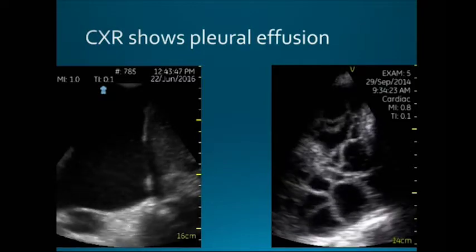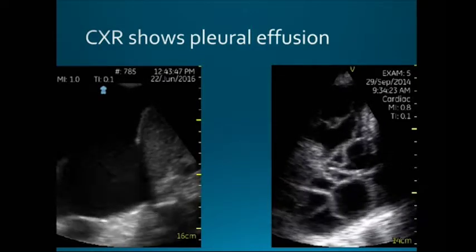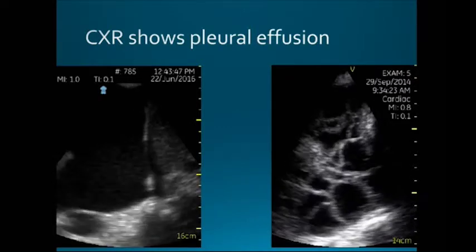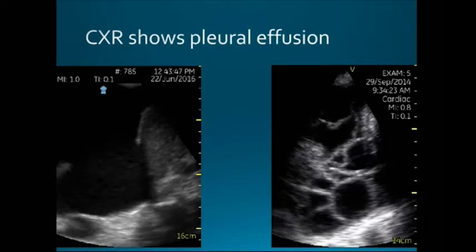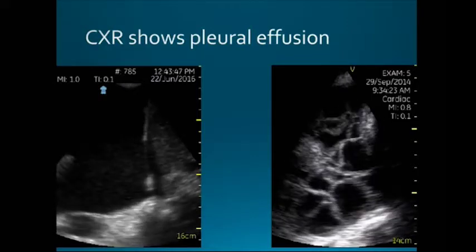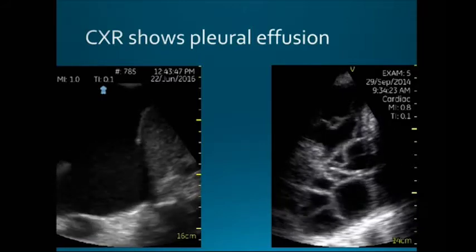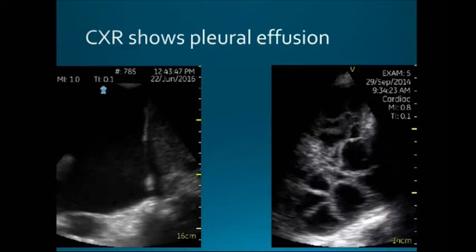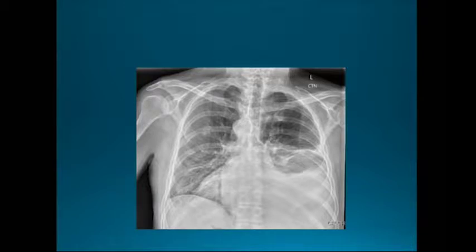But every once in a while, probably 2 or 3 times a year, we come across a thoracentesis, or not a thoracentesis, but prepping for a thoracentesis, and we see something that looks like there's a Lord of the Rings spider in there that laid a giant web and is filled with loculations and fibrinous strands. And this is not a TAP that's going to go well. This person really needs a chest tube with lytic therapy or a surgery with decortication, things like that. So it's helpful in terms of when to do a procedure.